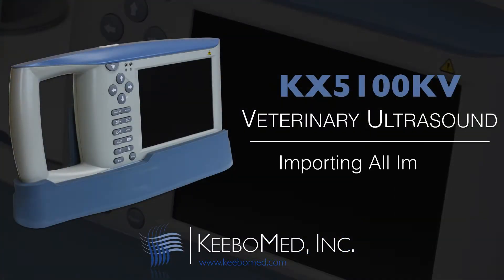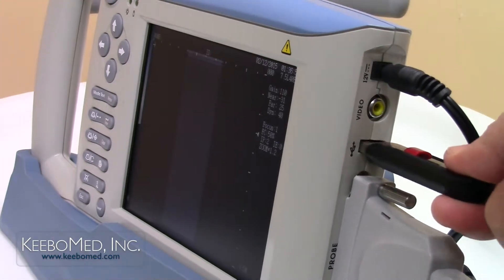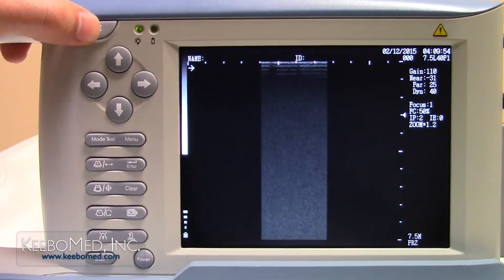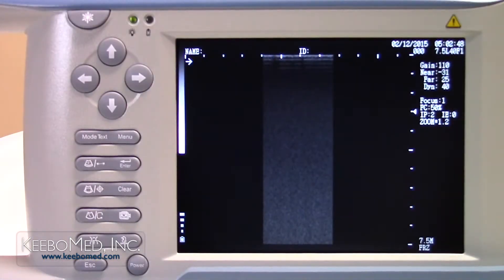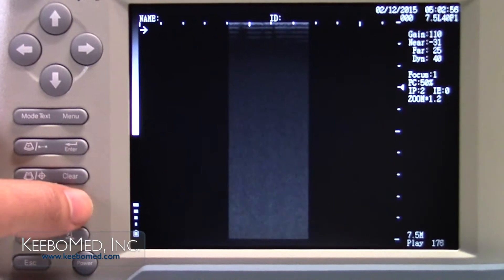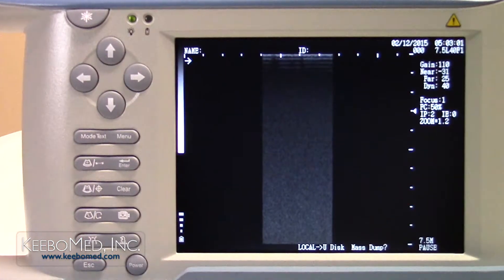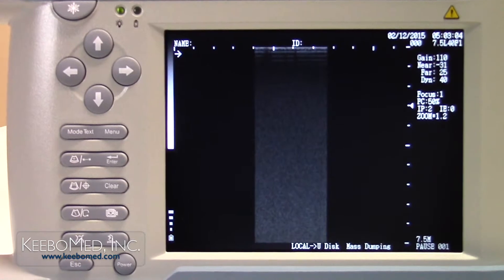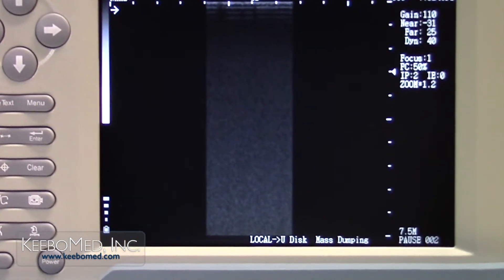To import all the images from the system to the USB drive, follow these steps. Step 1. Insert a USB drive into the USB port on the side of the ultrasound. Step 2. Press the freeze key to freeze the image. The letters FRZ will appear on the bottom right corner of the screen. Step 3. Press the save key three times until the pause prompt appears on the bottom right of the screen. Step 4. Press the mass dump key and a local to U-Disk mass dump question will appear. Step 5. Press the enter key and the dumping prompt will appear. Each image will now be imported to the USB drive. When the import is complete, the system will return to the pause state.